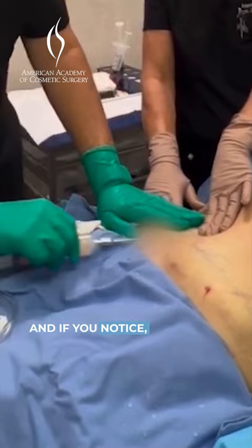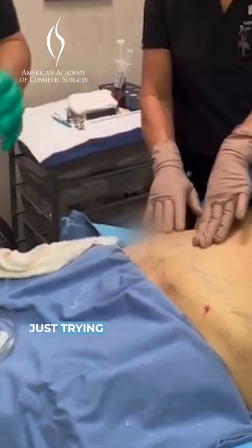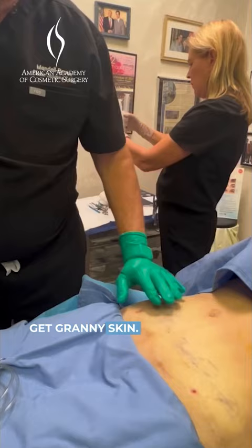I'm just going back and forth in motions, and we're just trying to get fat out. This cannula is called the Tri-Port Cannula. It's got three tiny holes. We made one, two, three openings, each about two millimeters.